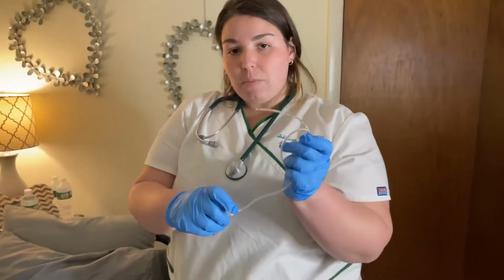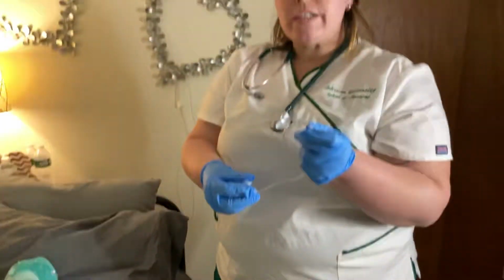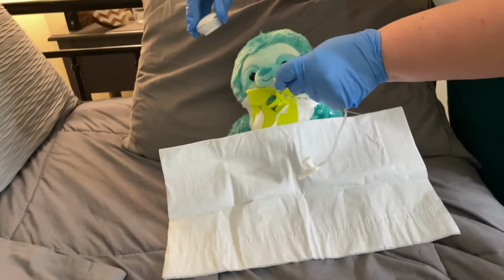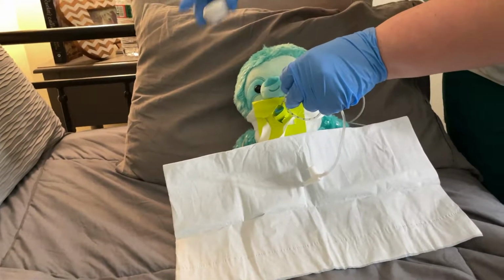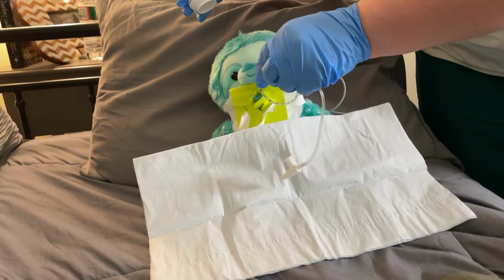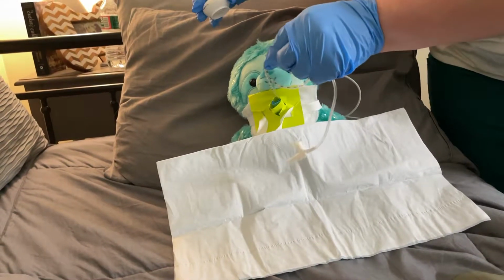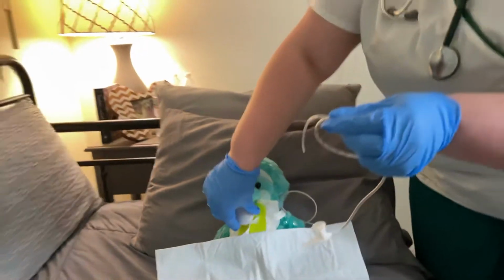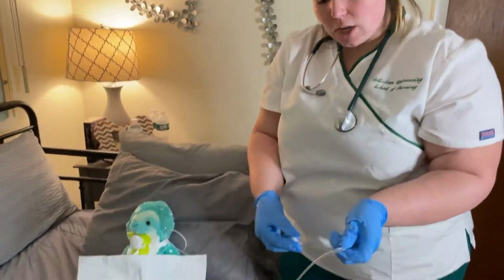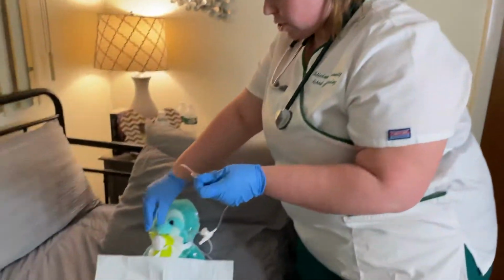You're going to stick the tip of the suction tubing into the saline and suck up some of the saline to clear the tubing. We're going to do the same thing 2 times. Remove the oxygen, put the tubing down the inner cannula 12 to 13 centimeters, withdraw, slightly swirling, for 10 to 15 seconds, replace the oxygen. While you're withdrawing, make sure you're intermittently hitting the suction. Put it into the saline and suck some of the saline through to clear the tubing. And we're going to do the same thing.